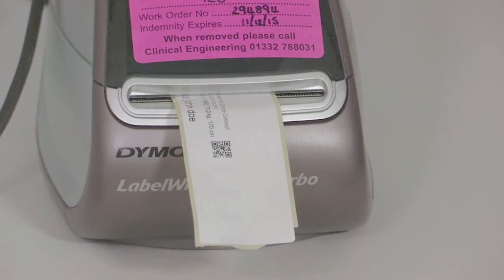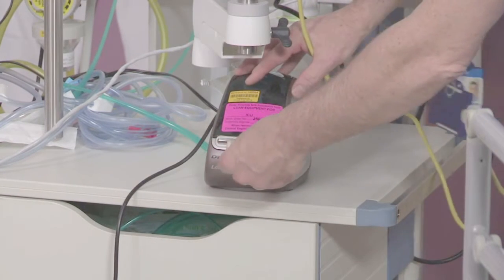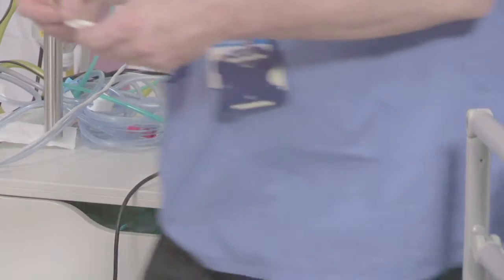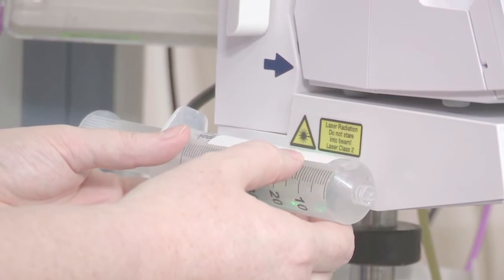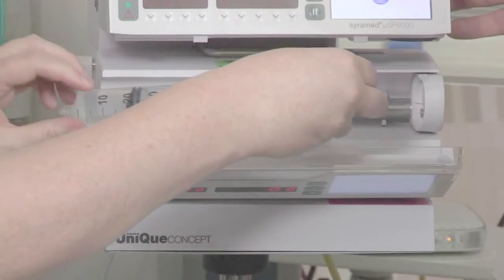A label printed from the dose administration screen of the prescribing system provides both legible written primary information and the same contained in a barcode format. The barcode can also contain additional advanced information such as the patient's working mass for that drug, dose ranges specific to that patient, batch numbers, expiry dates, and even the correct device required for that infusion.